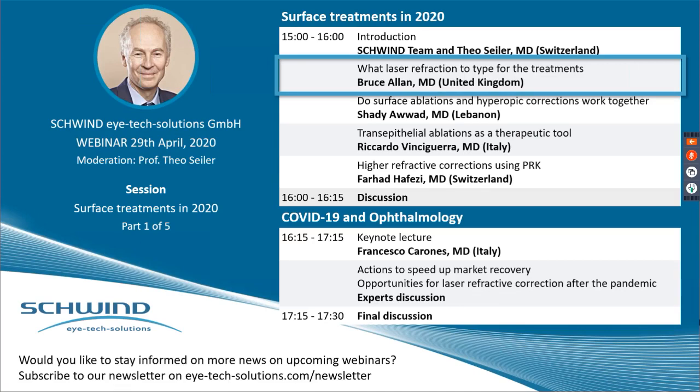Yeah. So I understand that for keratoconus, if you can measure the ocular wavefront, it is better anyway, because it includes also the back surface of the cornea, which would be missed in corneal wavefront. So that is a major point forward. But, Bruce, not in all keratoconus eyes does the ocular wavefront work. So it is for sure in stage 1, Amsler-Krumeich stage 1, and maybe even in stage 2. But what about 3 and 4?